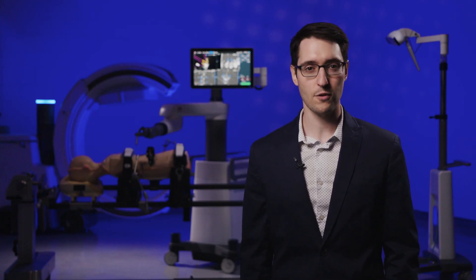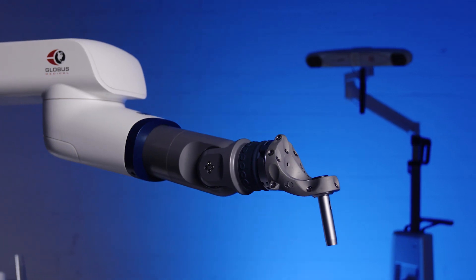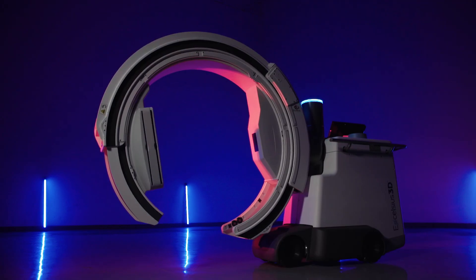Excelsius Prone Lateral combines the most advanced technologies into one surgical solution in order to provide excellent stability, minimize surgeon fatigue, and maximize operational efficiencies. Today we'll be focusing on the main components of this solution including the prone lateral patient positioning system, Excelsius GPS robotic navigation platform, expandable interbody spacer technology, and Excelsius 3D.